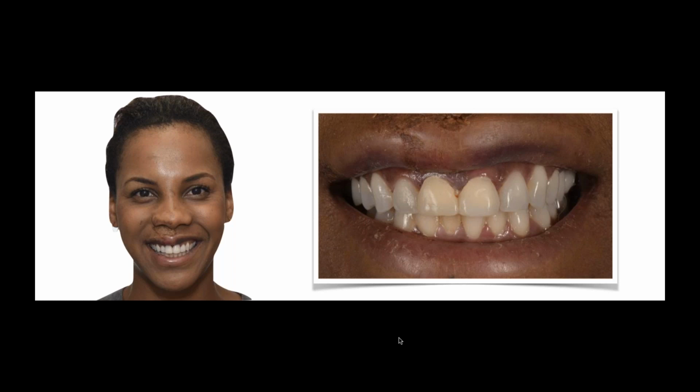And that's why the photography part is so important for us, because it really is a factual representation of what we're trying to see. And without it, we're a little lost. So if you look at my friend Tracy here, you can see that she actually fell. She had an accident and she broke her front tooth. She actually knocked out a tooth, chipped it off pretty bad.